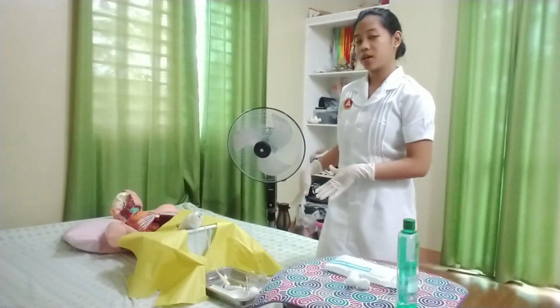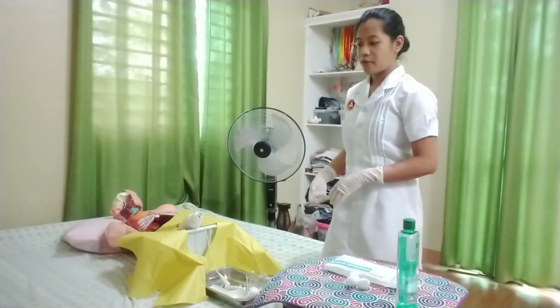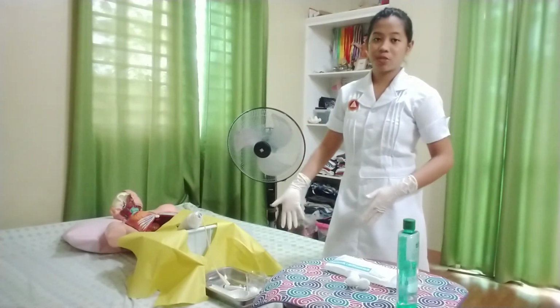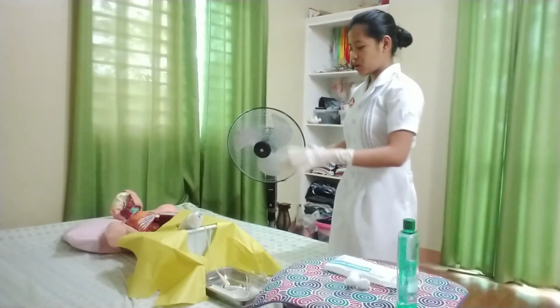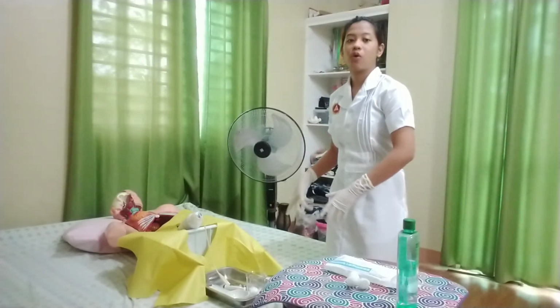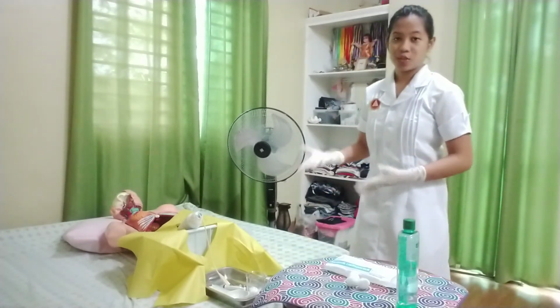Also, I will be checking if the drainage tubing is not kinked and if the movement of the side rails will not interfere with the drainage bag and the catheter. So after checking all of that and making sure that it is all good, I will hang the drainage bag below the bed as well.